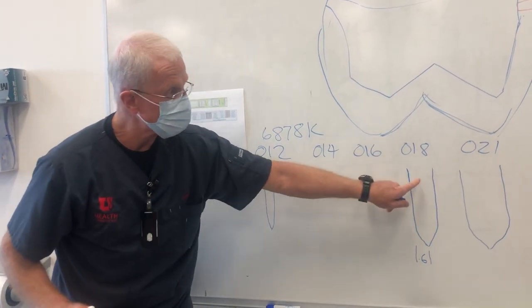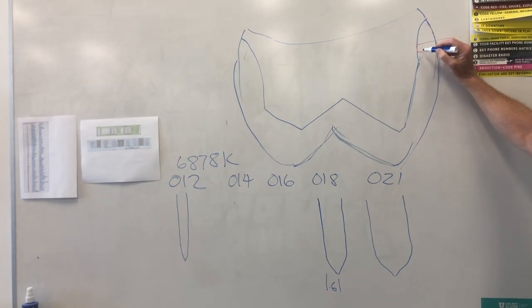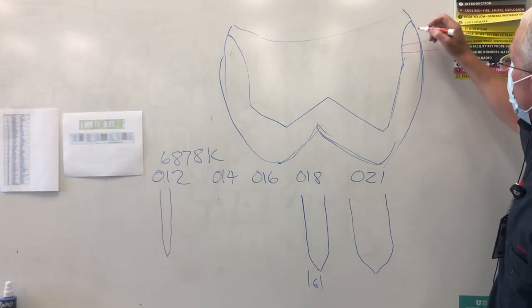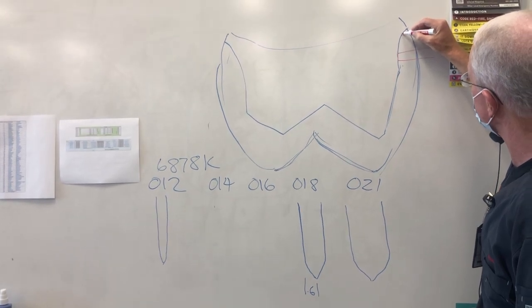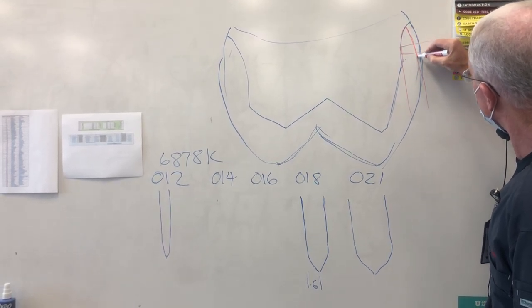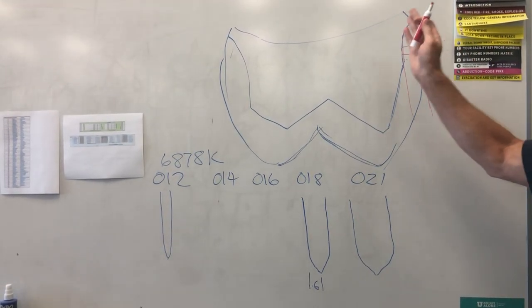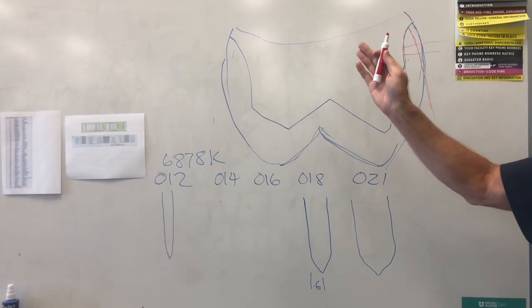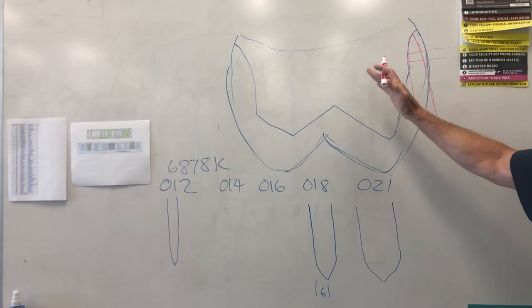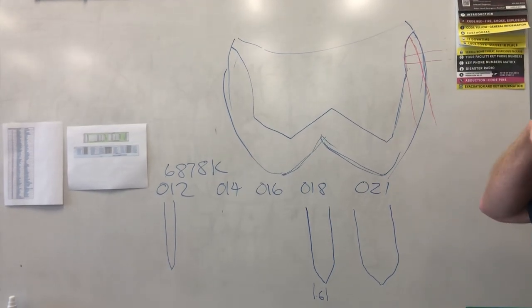So even with the diamond, this fat 018, you're not going to be able to get to the depth of 1 millimeter without walking the burr, for lack of a better term, up the axial wall a little bit. So with your 018, you're going to be about like this. Does that make sense? It won't prepare the entire depth. It's not a big enough burr in diameter to do that. So the way you do it is you simply move it down the wall as you're doing the preparation, as you're going deeper. So it's a whole different technique than we use with the rounded shoulder torpedo burr, right?